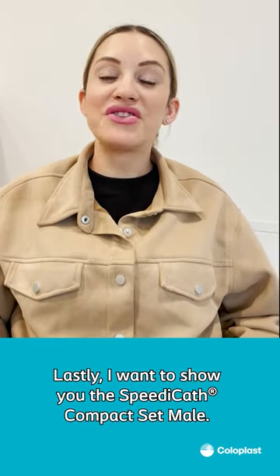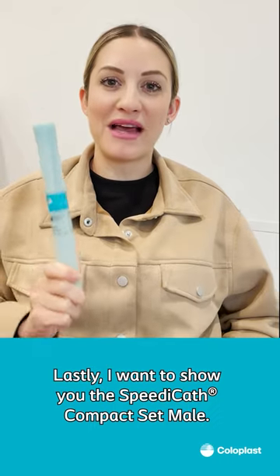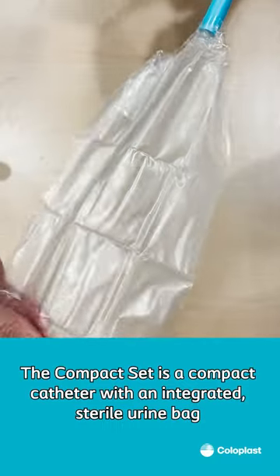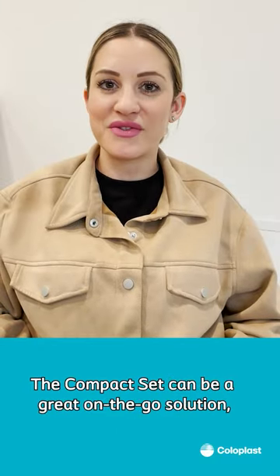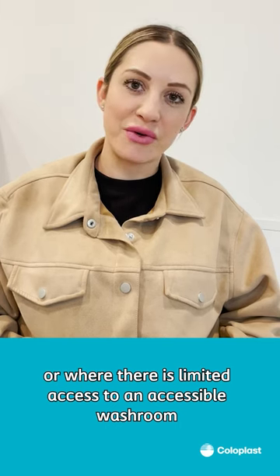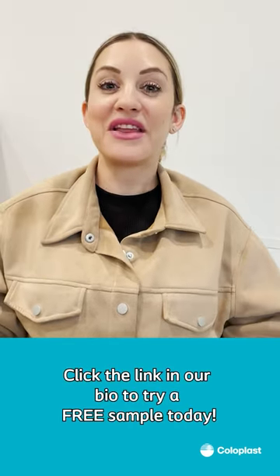Lastly, I want to show you the SpeedyCath Compact Set Male. The Compact Set is a compact catheter with an integrated sterile urine bag. The Compact Set can be a great on-the-go solution or when there's limited access to accessible washrooms, such as on an airplane. Click the link in our bio to try a free sample today.